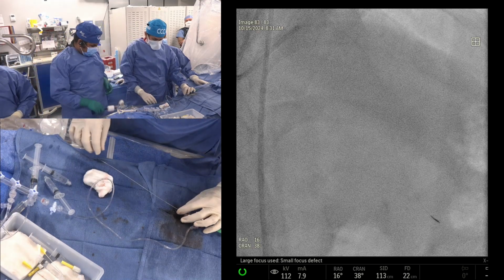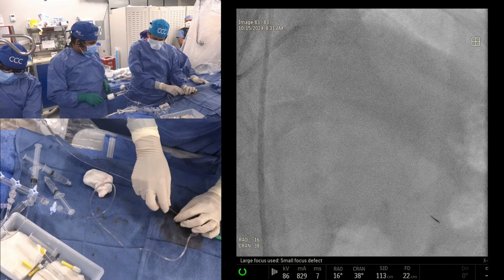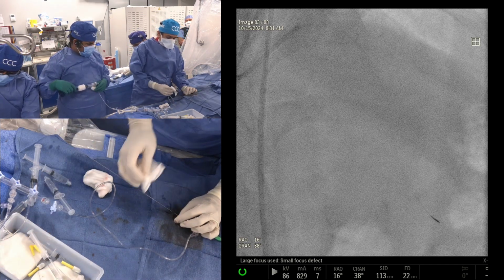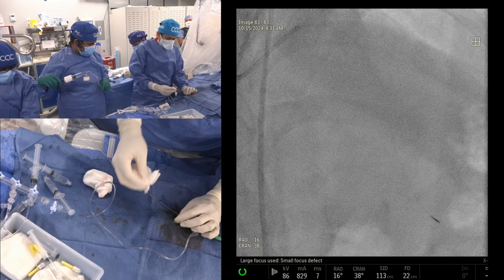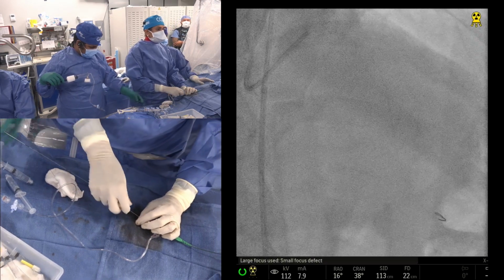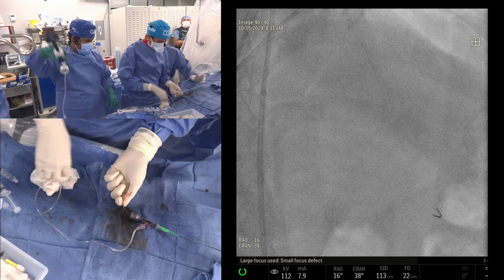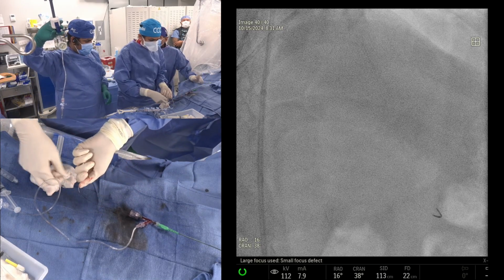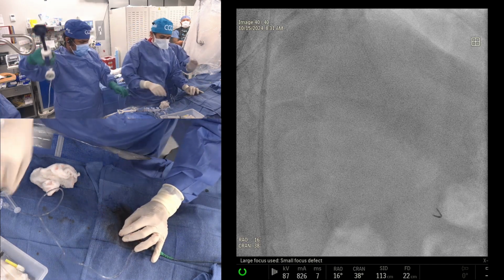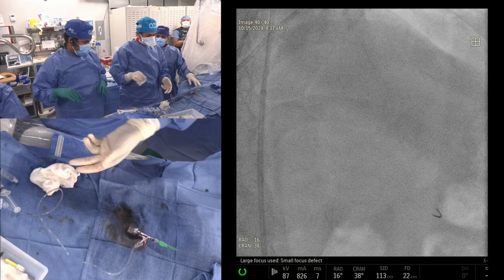I know several comments, mainly complimenting the excellent technique, and no intimal dissection. We try not to do intimal dissection. This is one thing that we want to promote and keep teaching: to avoid the subintimal dissections and re-entry. I'm not a believer of that. The data have shown that subintimal dissection has a higher restenosis and comes back with total occlusion. Therefore, the use of the Stingray and all that has significantly gone down.